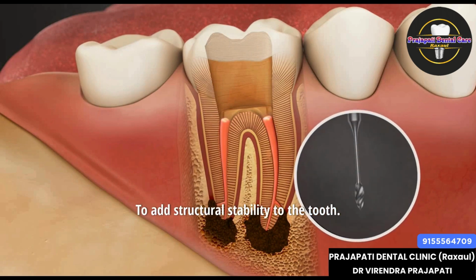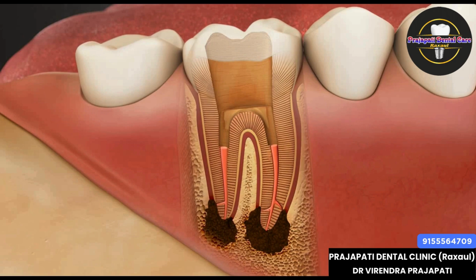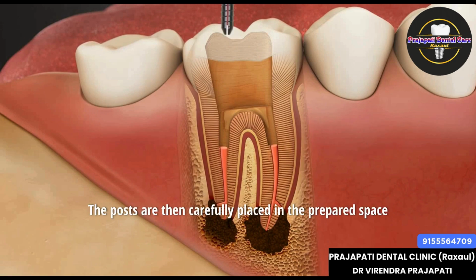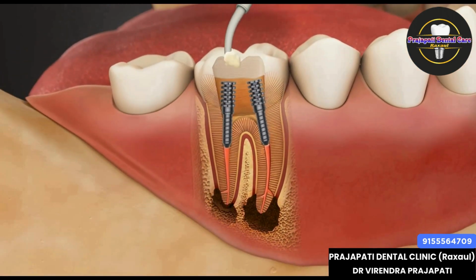To add structural stability to the tooth, the canal spaces are further prepared to allow for the placement of reinforcing posts. The posts are then carefully placed in the prepared space as a dense filling material is inserted into the tooth cavity.